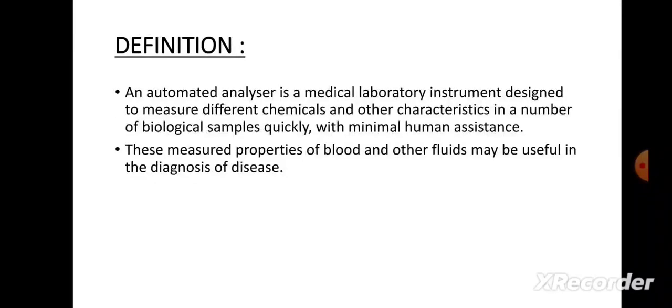Definition. An automated analyzer is a medical laboratory instrument or device that performs chemical analysis automatically. These measured properties of blood and other fluids may be useful in the diagnosis of disease.